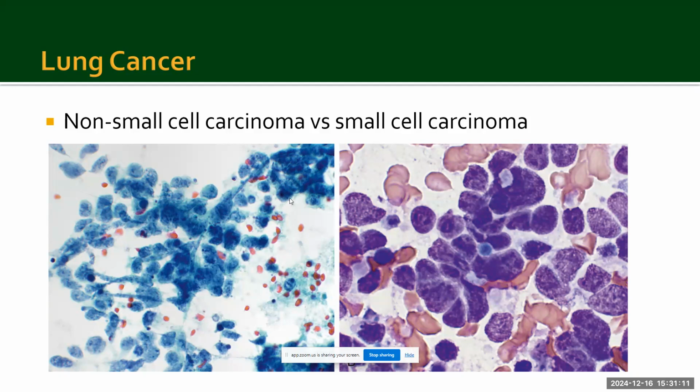First, I will try to determine whether I would call any carcinoma small cell versus non-small cell. So what are the features of small cell carcinoma? If we are seeing clusters of small round blue cells with a lot of crushing artifact, molding, here you can see a lot of cells showing molding and crushing artifact with frequent apoptotic bodies. These dot-like figures in the background are the apoptotic bodies, with scant cytoplasm, and it is very cellular. That raises the suspicion of small cell carcinoma.